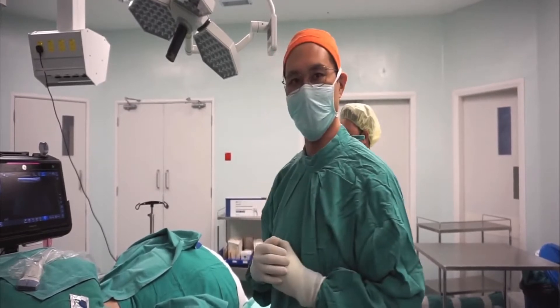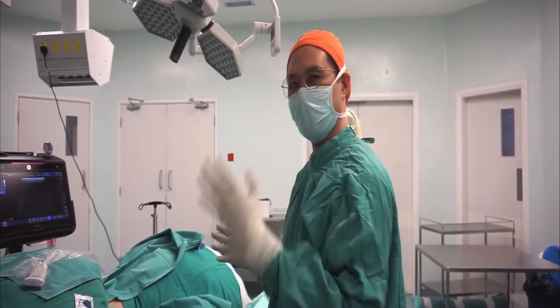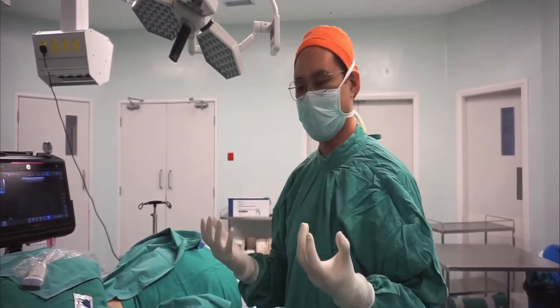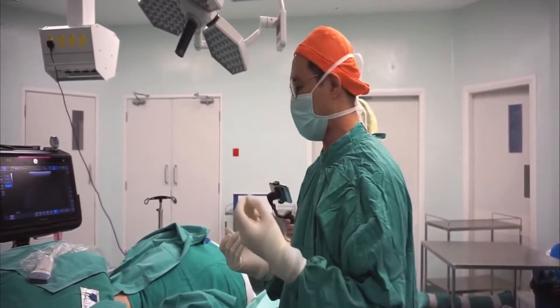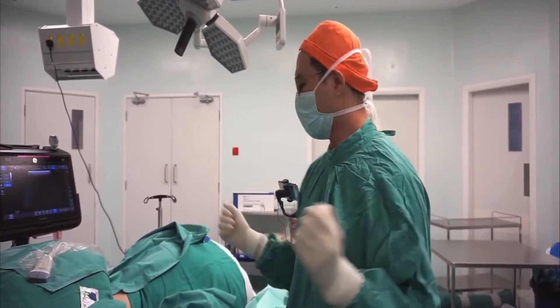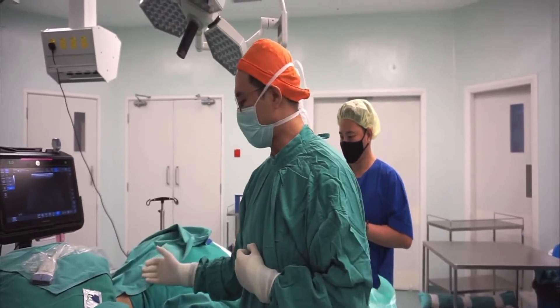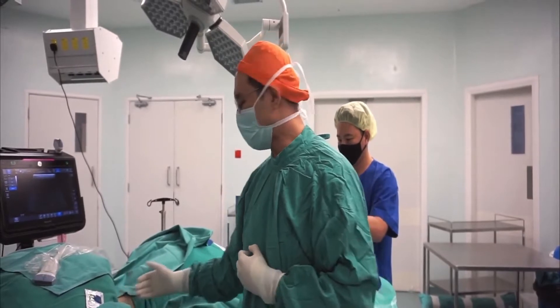We are looking to block the dermatome area between T8 to L1. Previous case studies have shown that a single injection at the thoracic level of the Erector Spinae Plane can spread as wide as eight vertebral levels. So today we are going to perform the block at roughly T10, hoping the local anesthetic will spread as high as T6 and as low as L2.